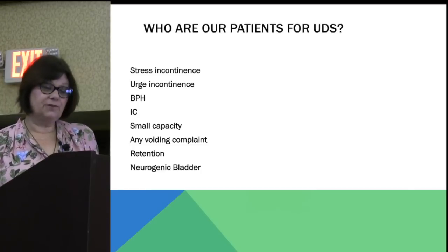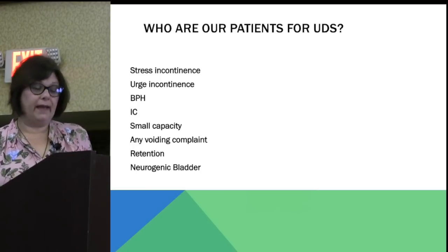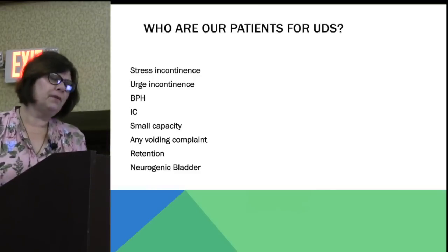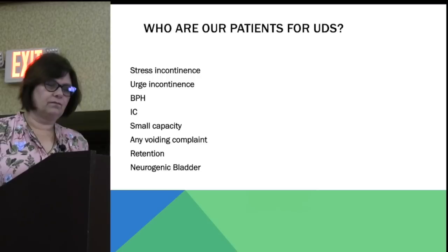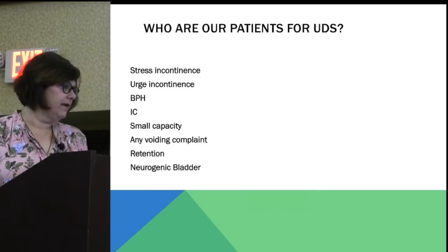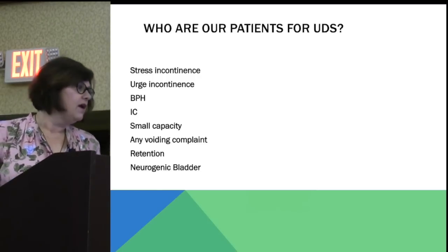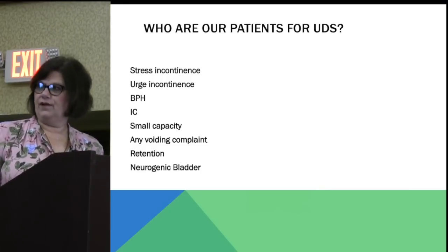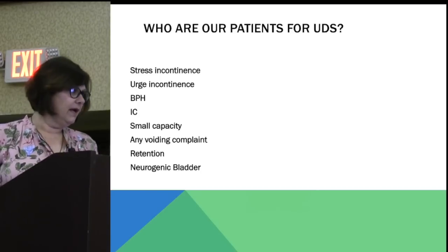BPH, so guys with enlarged prostates. People with interstitial cystitis or complaints of pain, or I've got to go all the time. Anyone who complains of a small capacity, again, not necessarily with pain, but I'm in the bathroom all the time. I can't figure out what's going on. Is it an infection? Is it this? Is it that? And you can't really get down to the answer. Urodynamics is a great way to figure out what's going on. And really any voiding complaint.